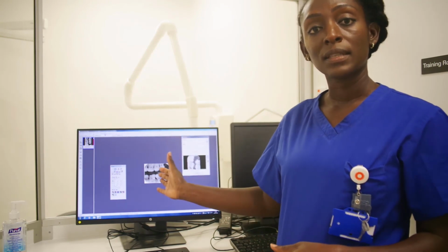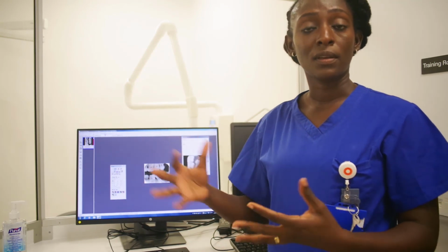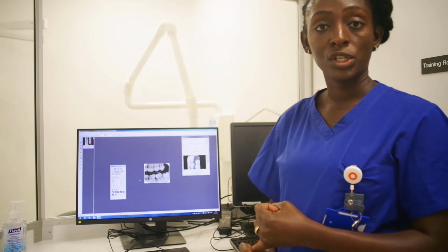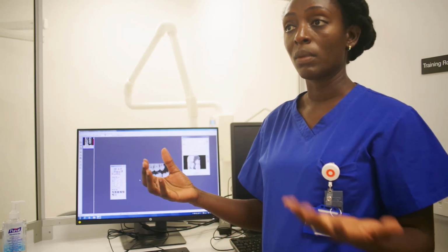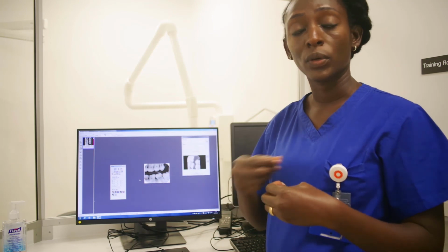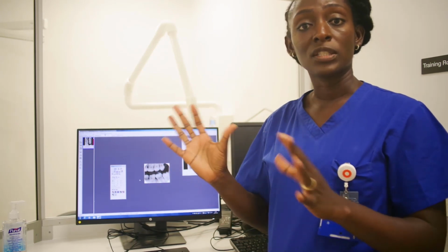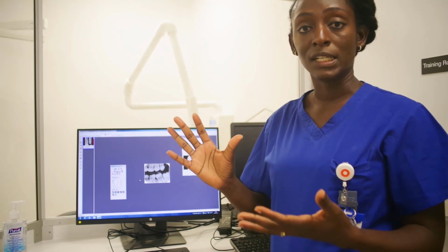So looking at this image, we're going to grade it using the NRPB grading. So looking at it, would you say there's any preparation error? So preparation error, have they got any dentures? Have they got any tongue piercing? Is there any movement suggesting that you didn't prepare your patient adequately? No.